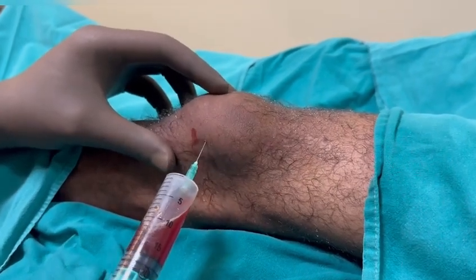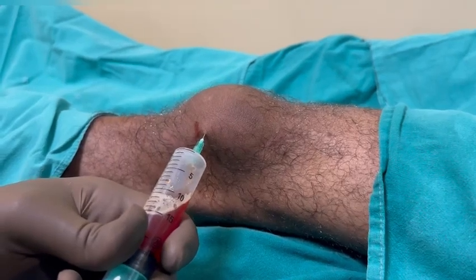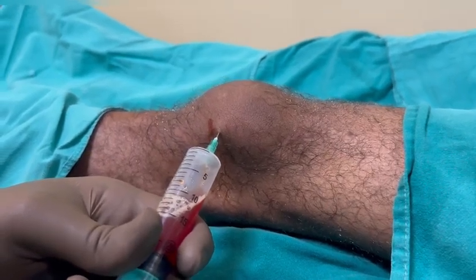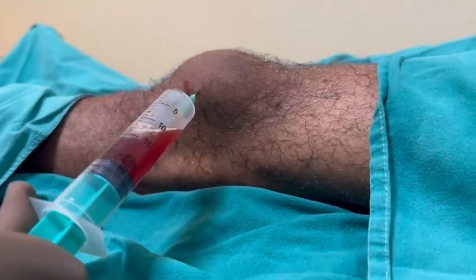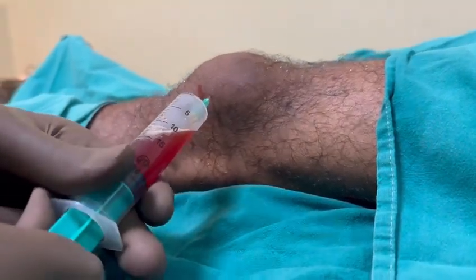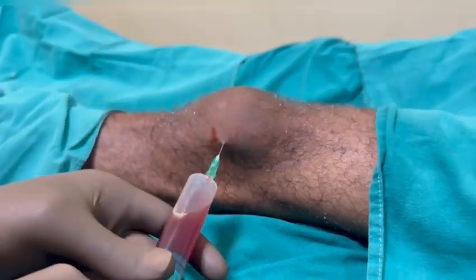Whenever you aspirate a bursa, if you are in the right spot, you will aspirate a serosanguineous fluid — there will be an element of blood in it, and it will always look red, unlike the yellow straw-colored fluid that you sometimes aspirate from the knee joint. This is the normal color for bursal fluid.